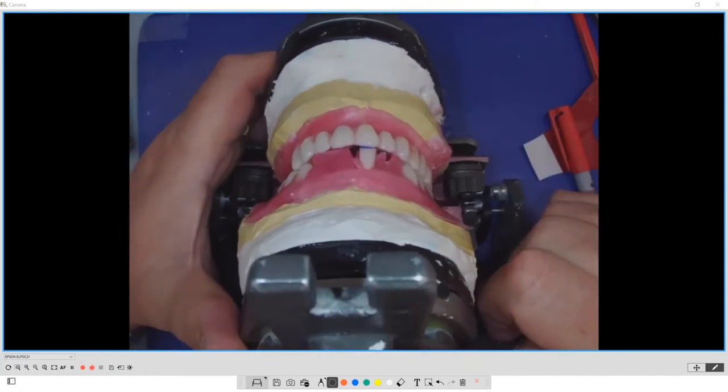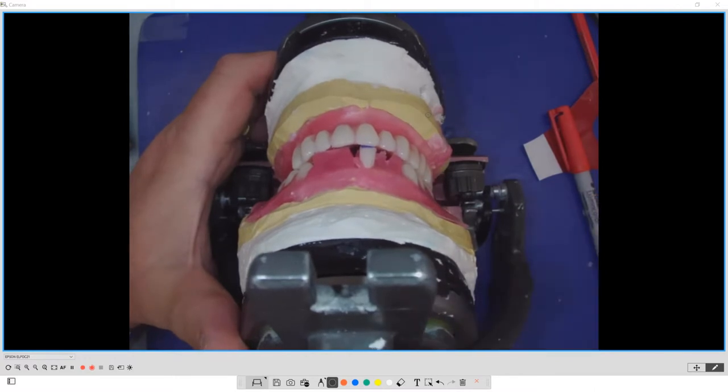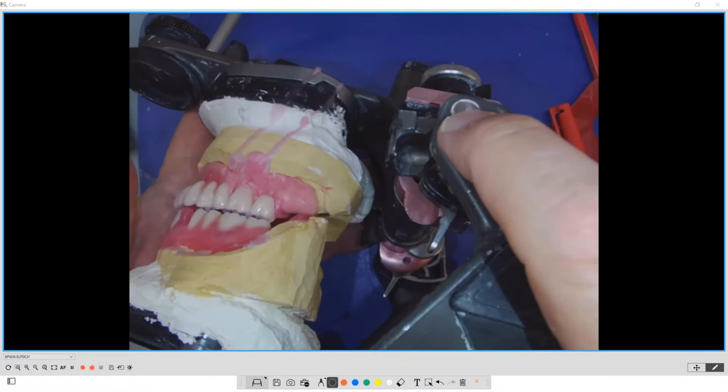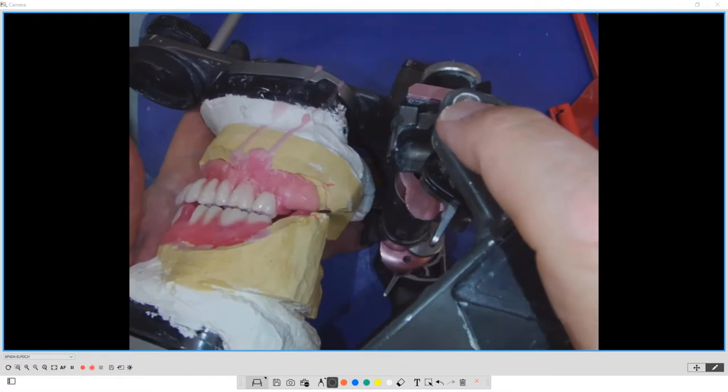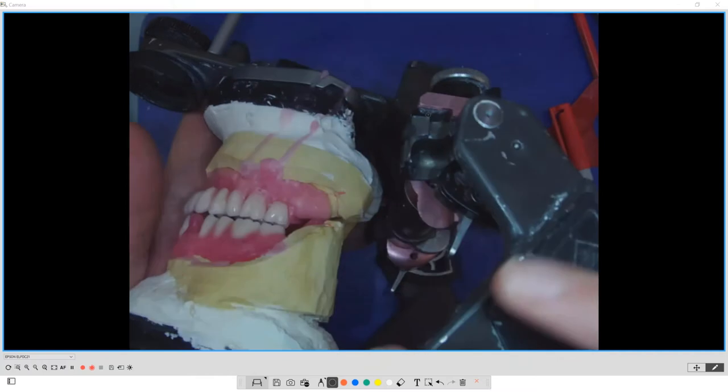I sit all over the place because I'm watching the person and then I check. You have to appreciate that each person has a specific condylar angle for them. A condylar angle is usually set at 30 degrees, but how do I know it's 30? That 30 affects tooth position and how the patient postures.